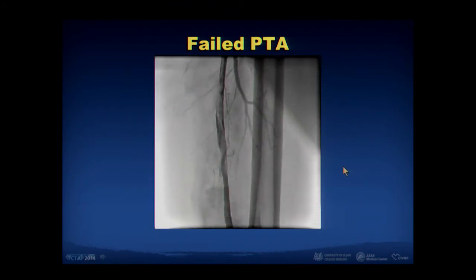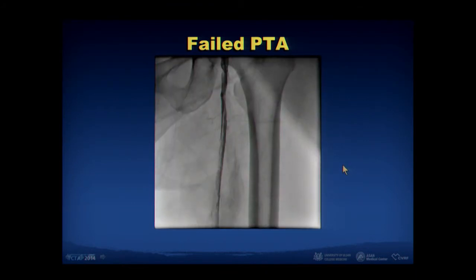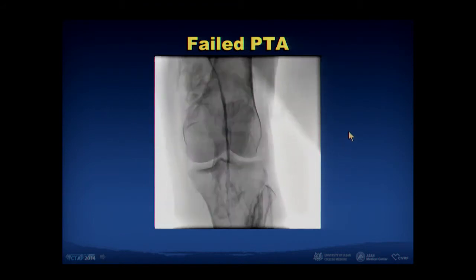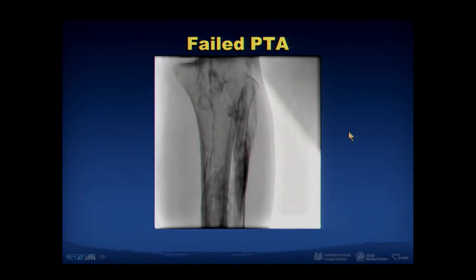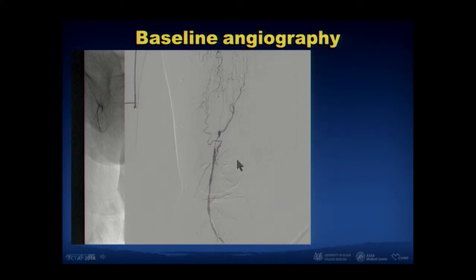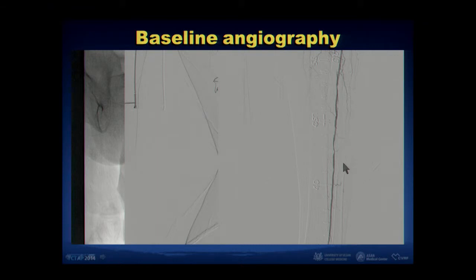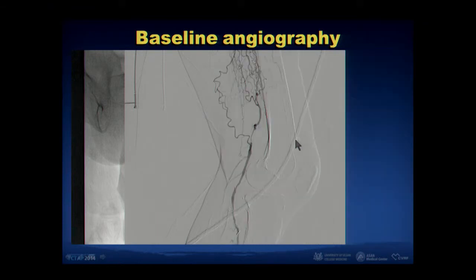So I think confirmation of the wire tip is very important before balloon angioplasty. Anyway, this patient was transferred to our hospital. We checked angiography again. You can see some flow here, and then popliteal total occlusion. The lateral projection showed the popliteal occlusion. This is the ATA.